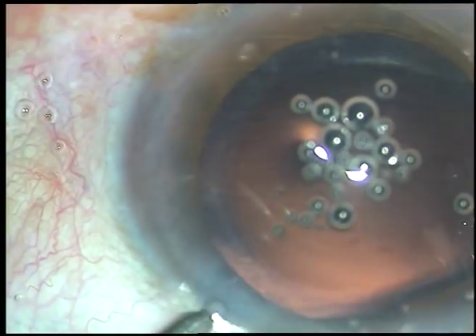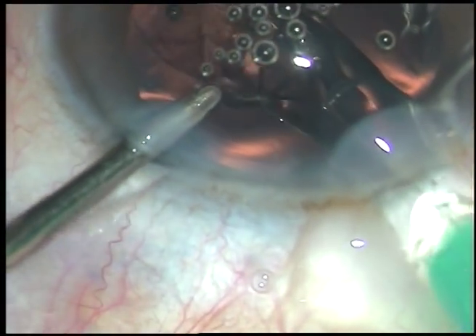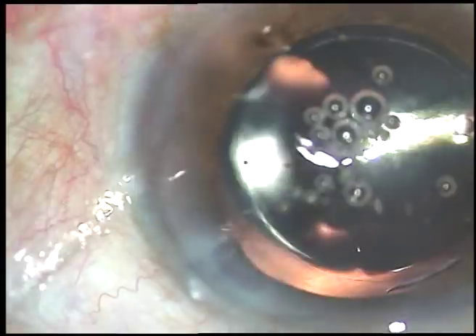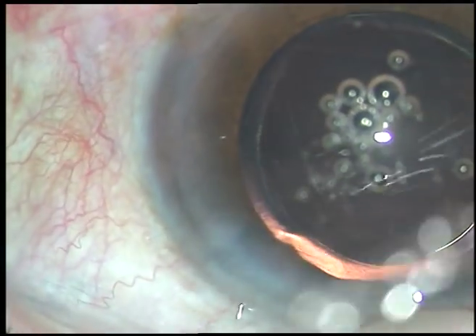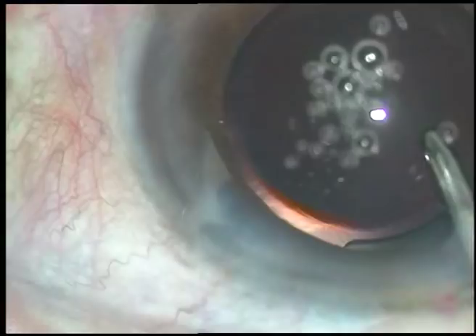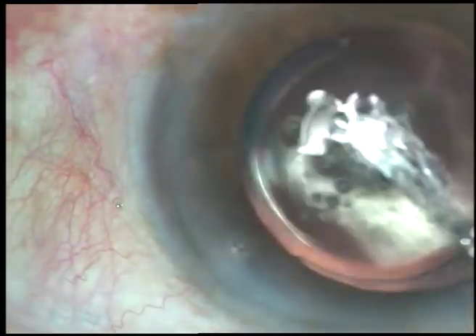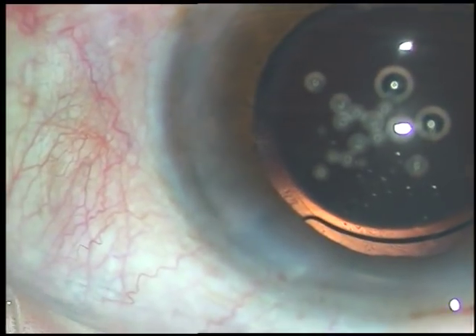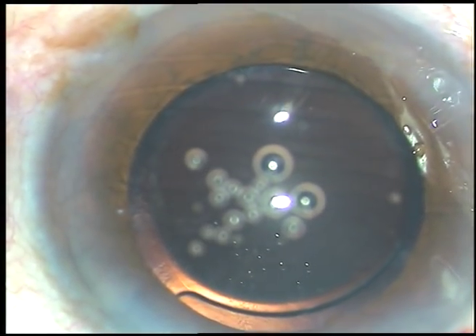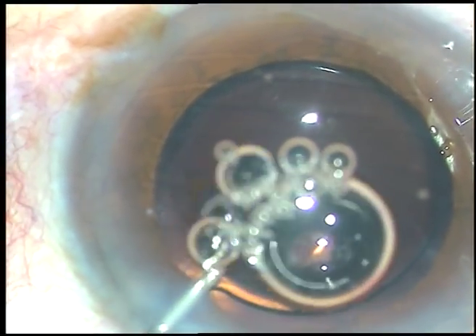In this case we have selected a hydrophilic acrylic intraocular lens. The intraocular lens is being implanted keeping the anterior chamber formed under irrigating fluid. The lens is placed in the capsular bag. I saw there is a lot of leakage from the side port, so I am going to use an air bubble because the anterior chamber became very shallow. An air bubble is injected into the anterior chamber and the anterior chamber is made deep.